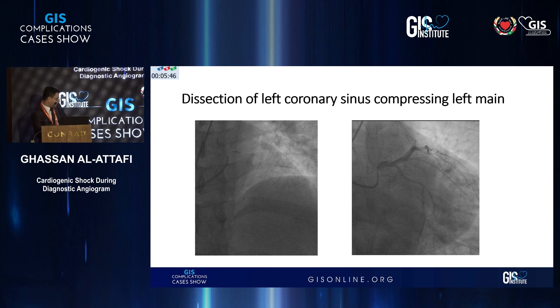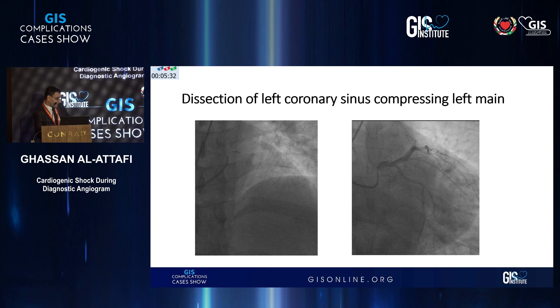This is a balance of probability. Of course, you could leave it and nothing might happen, but if something does happen you're never going to forgive yourself. There is high potential that this could propagate. You could intervene and cause problems too — it's a balanced probability. But this is clearly a Class 1 classification dissection.